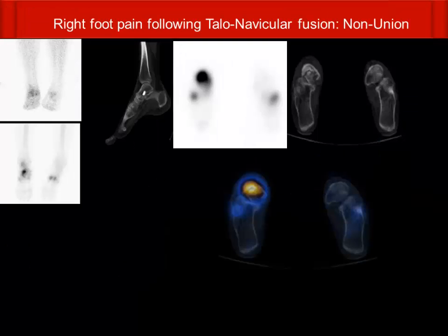The last example is a patient with right foot pain who had a talonavicular fusion. On these images you can see it is not completely fused — there is a breach in the cortex with sclerosis and cortical irregularity. The focal uptake corresponds to this area, which is a classical finding of nonunion and is the cause of the patient's pain.